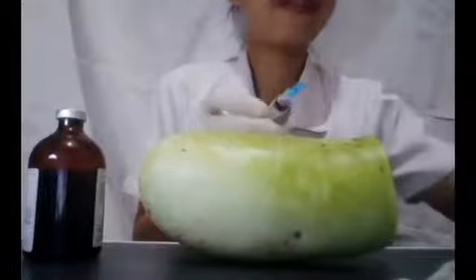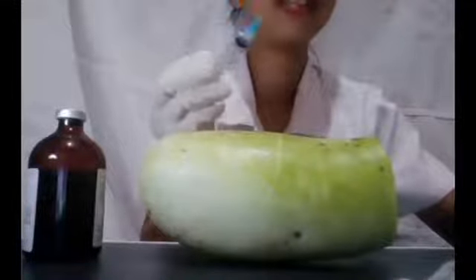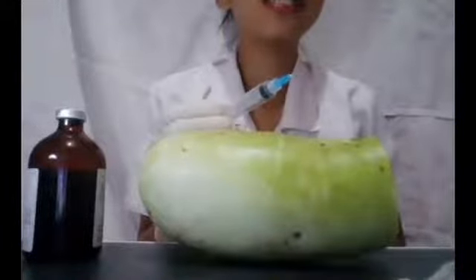So I have, this is not a safety needle, so if you have access to a safety needle, which is the kind that has a little device in it where you can lock it after you give the injection, definitely use that instead. I just don't have access to it, so that's why I have this kind of needle.